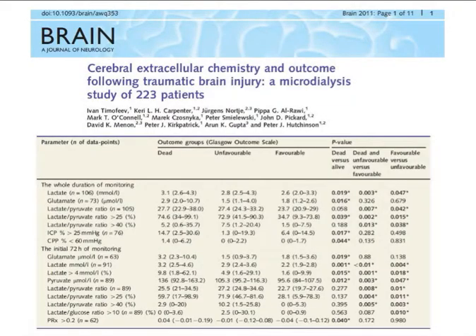And then if we talk about why this is useful, I think that this paper from the Cambridge group is the largest study using cerebral microdialysis markers. They included more than 200 patients, and in this center they have really strict standardized protocols, and they have demonstrated that particularly elevated lactate to pyruvate ratio and low glucose are independent predictors of poor outcome, so that these can also be used in future studies, maybe as a physiological endpoint.